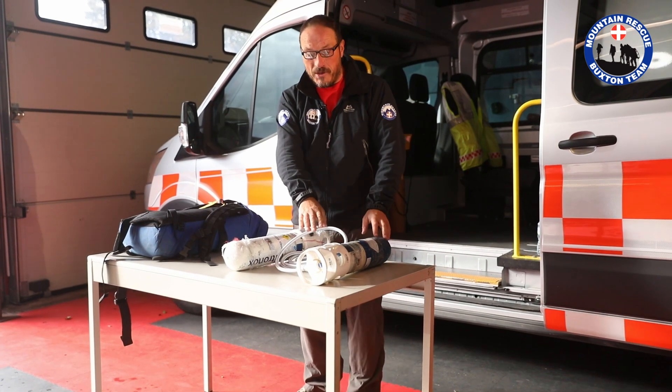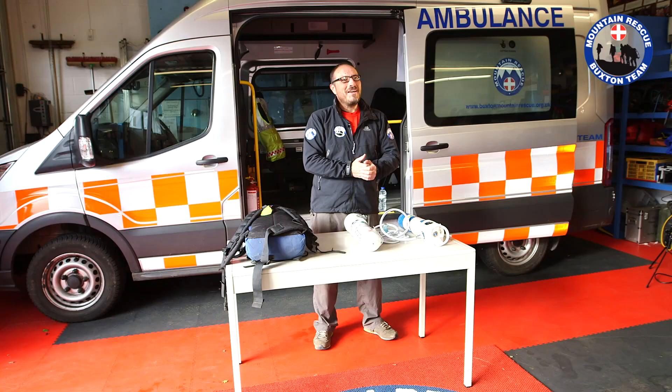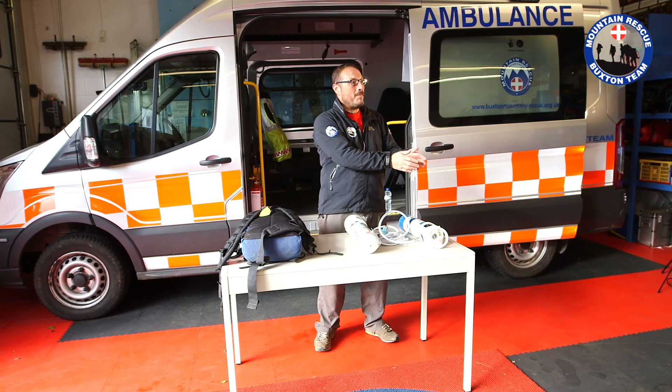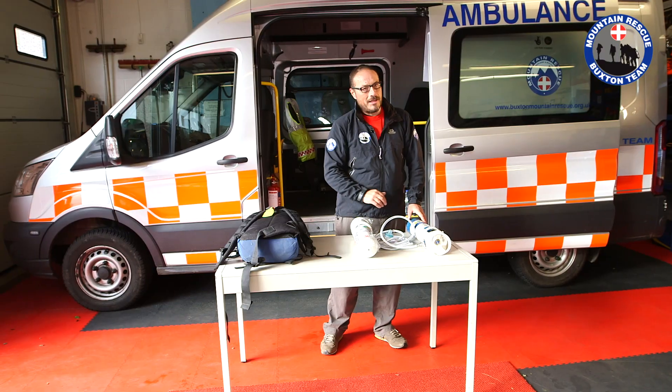Lefty Loosey. And as you all know, when you undo something, you leave it able to twist — that way we know it's undone. All of our hill-going team members are trained to assemble this, same as some of our other equipment. If, for instance, we have a casualty carer over here talking to the casualty, he or she can very quickly request would you please put the Entonox together, and any of our hill-going members should be able to assemble the Entonox giving kit.